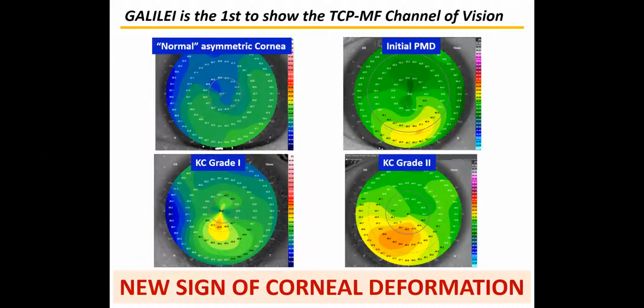And with this map, we began to discover this kind of deformation. This is a kind of functional deformation, as the pattern is representing how the optics is. So everybody who is more than 40 years old and uses multifocal glasses, if we can make a functional tomography of those glasses, we are going to see the channel of vision of the multifocality. This is exactly what happens in the cornea.